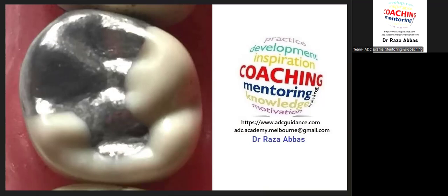Okay. Now, the other thing that you need to also understand is that ADC wants a clinically acceptable restoration, not an aesthetically acceptable restoration. Quite commonly, we see this misconception with candidates: my restoration doesn't look beautiful, or my restoration is too beautiful, I can't fail this task. That's a completely wrong concept that you have. ADC wants a clinically accepted restoration, not an aesthetically acceptable restoration.